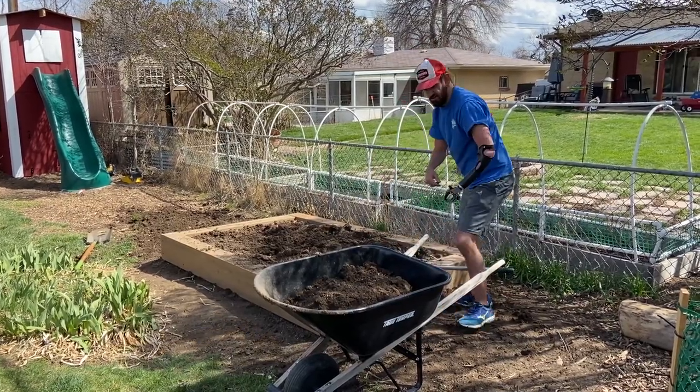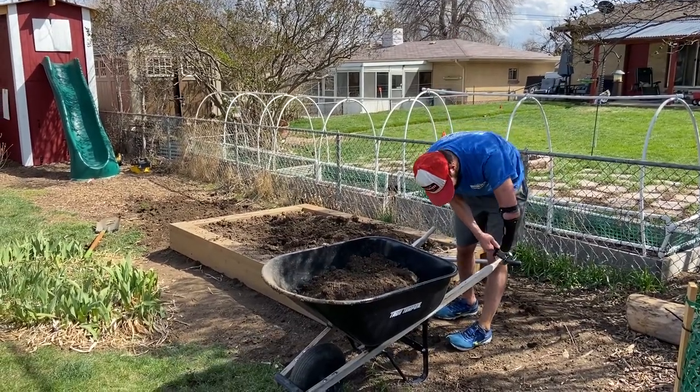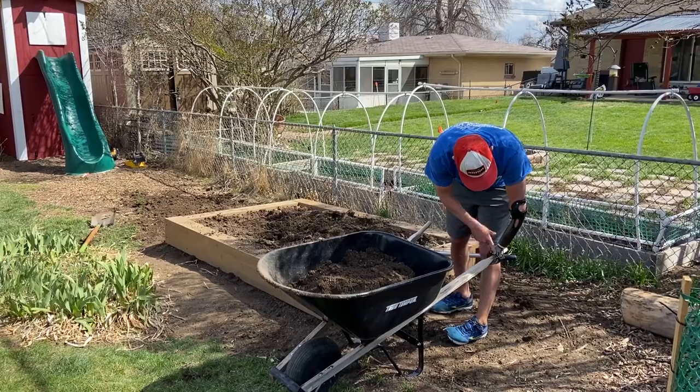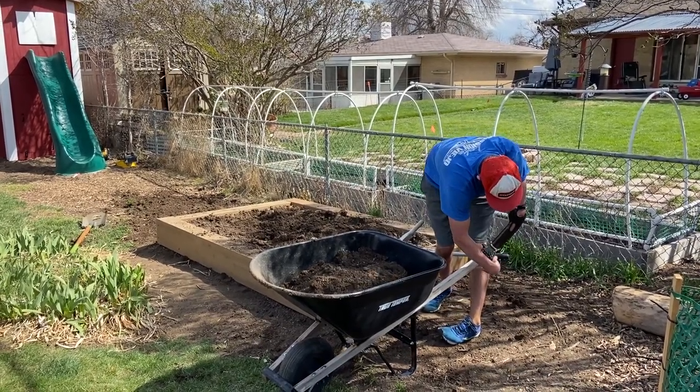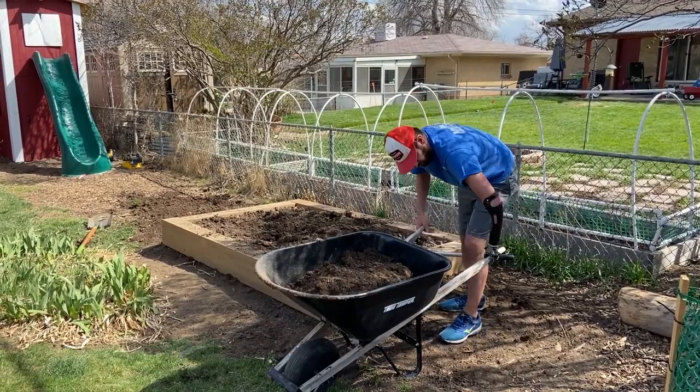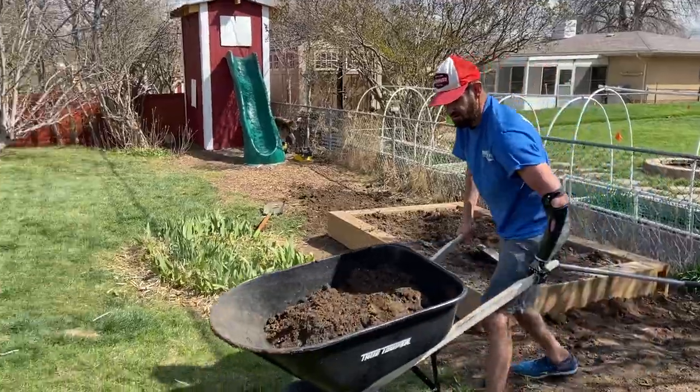If this wheelbarrow is full, I can adjust the tension with this clip here, adding to the pounds of pressure for release, but I can load a full wheelbarrow and it'll hold.